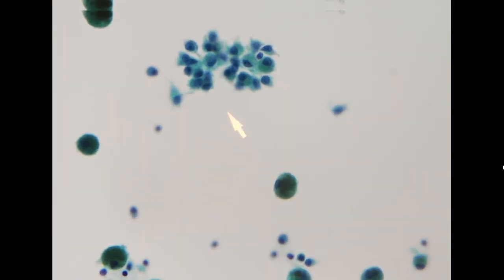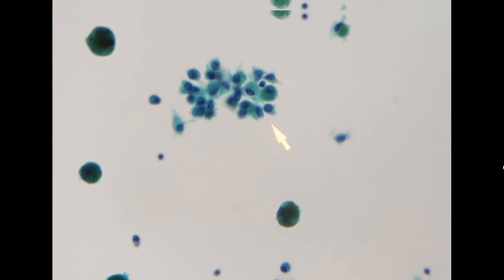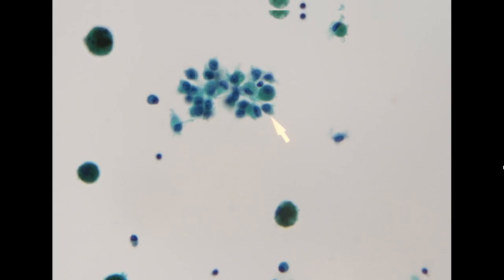For the cystic change, sometimes we will see this type of cells that look very much like histiocytes. And sometimes they can have some aggregation. So it is a little bit uncertain whether this is a true histiocytic origin or actually coming from tumor cells with cystic change. So we would describe these types of cells as atypical histiocytoid cells. If this is the only cellular component that we see, we might not be able to directly call these positive for metastatic carcinoma.